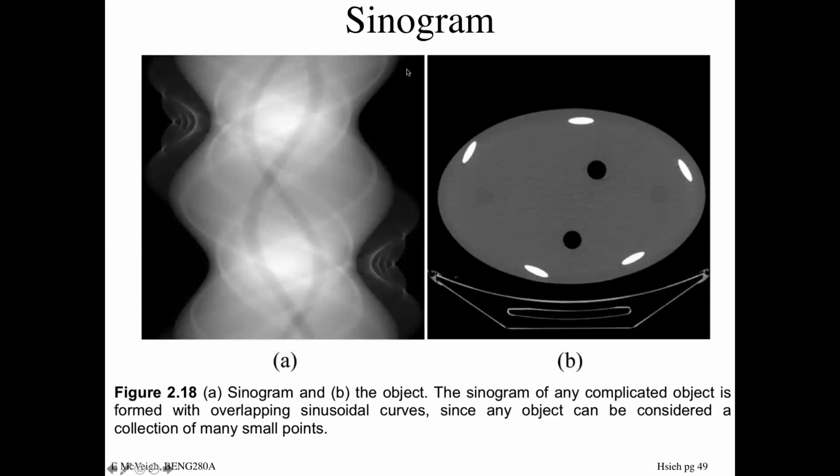And then the most obvious thing is there is a boundary here, right, which is the boundary of the object itself. So if I have a projection from either the top down to the bottom, like if I'm looking down this way, my beam, my x-rays are coming down through here, the projection will be very wide, and that's one of these extrema here.